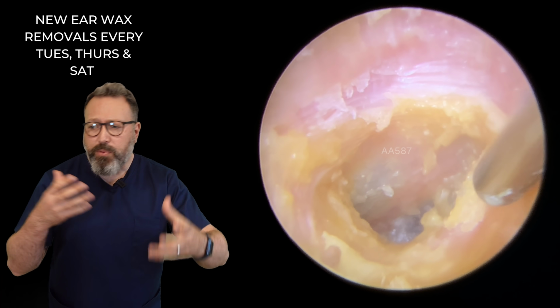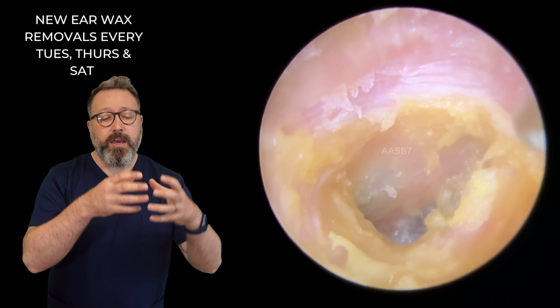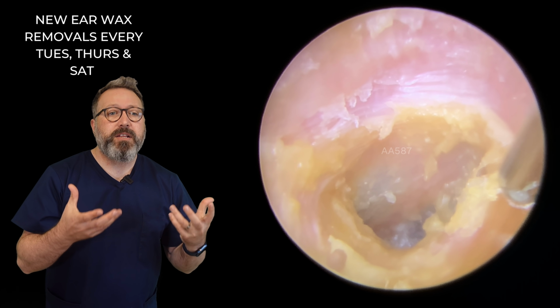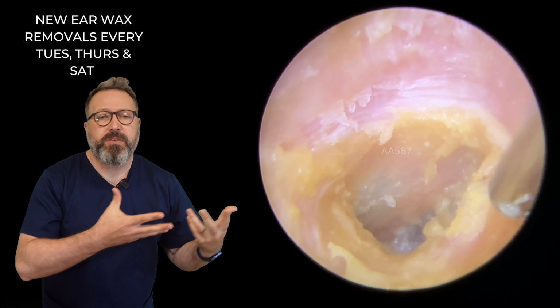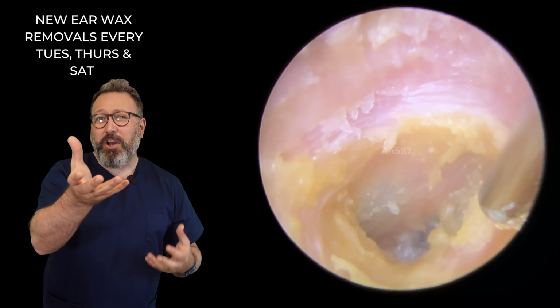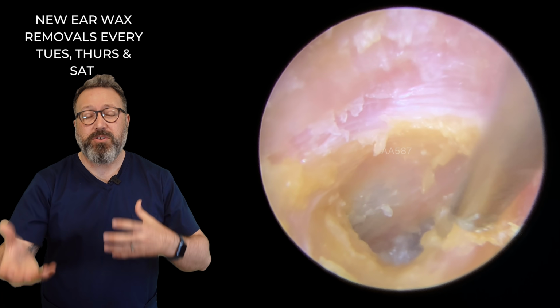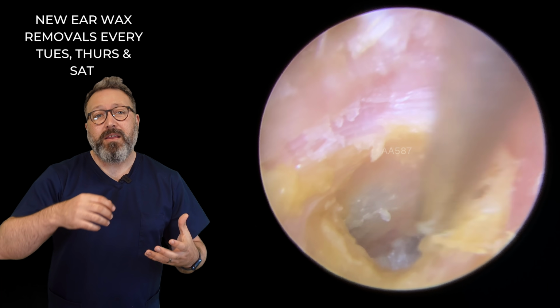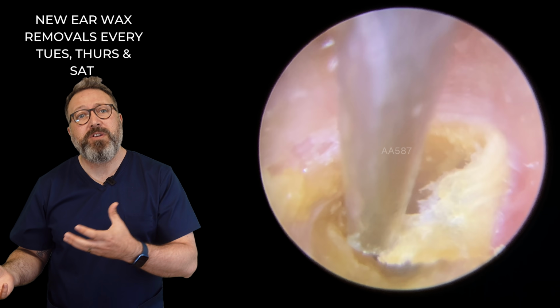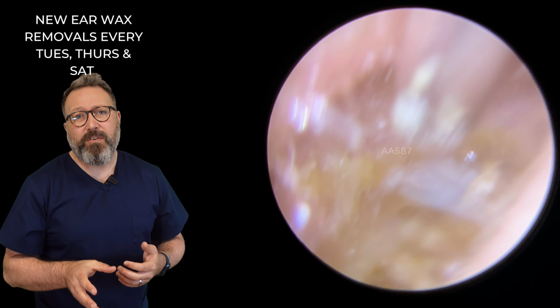So you've got different portions of the ear canal. The innermost portion, sorry, my throat's a bit dry today. The innermost portion is basically surrounded by your skull, which means that the skin in that particular portion, as it tries to migrate out the ear canal, can take bits of dead skin away, but not really chunky pieces like this. So if you don't remove this using suction or get it out manually, then it's going to stay in there, it's going to keep drying off, and this patient's going to have even more trouble again.